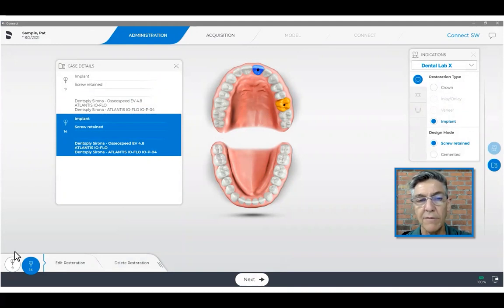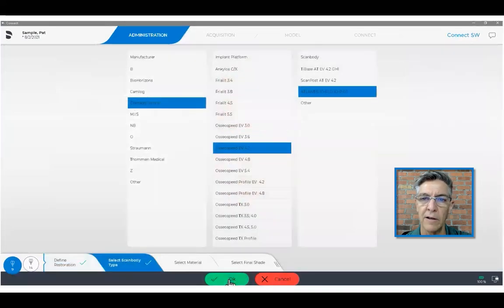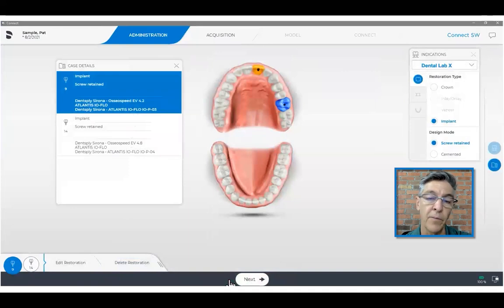However, if the implants are different, then you want to edit that particular one that is different — in this case, the central incisor. So we're going to go back to our scan body selection, choose the right one, okay it, and then move on. Once done, we're ready to record the video.